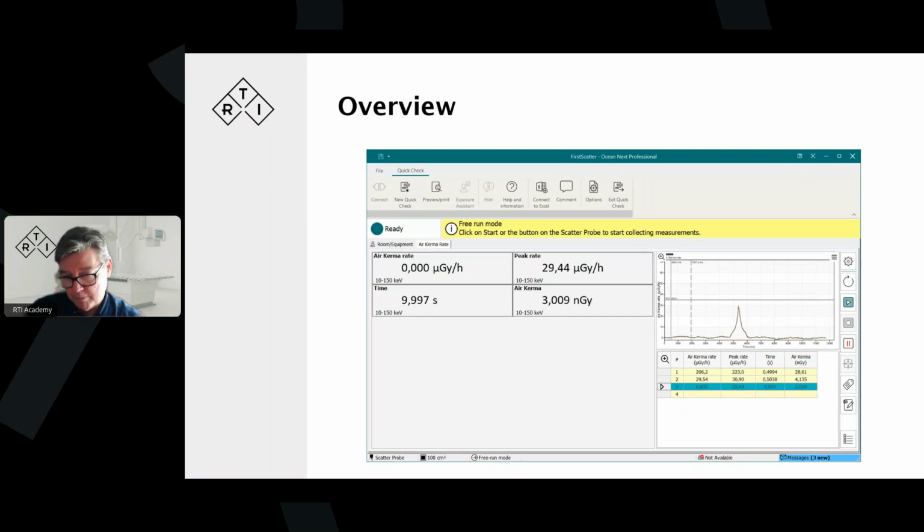Put that into the formula for the workload. How many exposures like this is it? And then you make all the calculations. You do that in the 5 directions at 1 meter distance from the tube head. That's what you do for leakage.